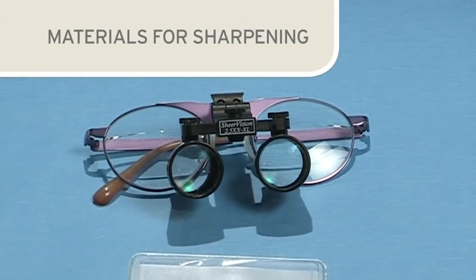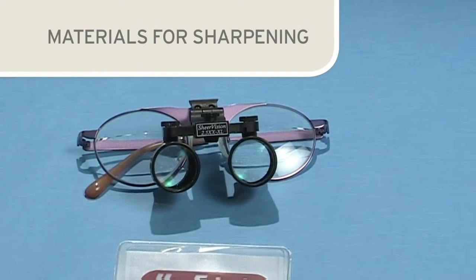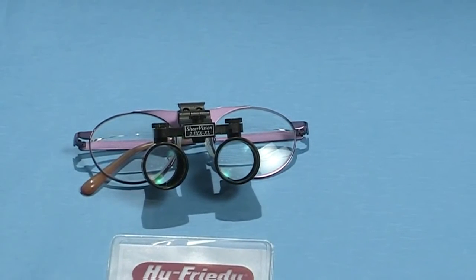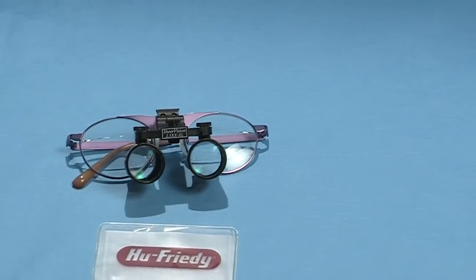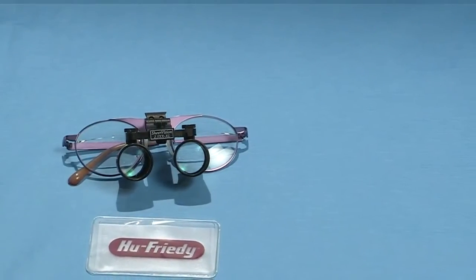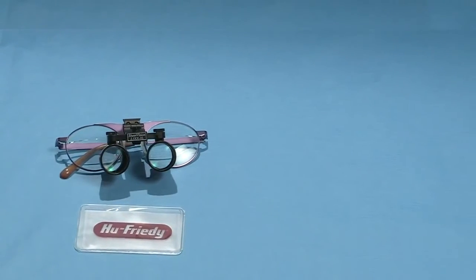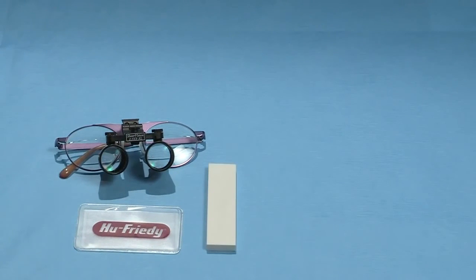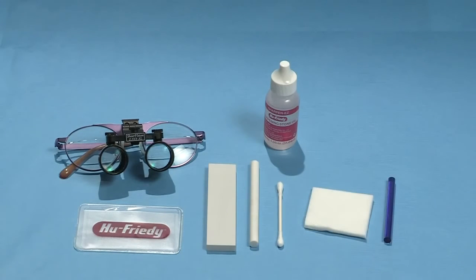Before beginning the sharpening process for sickle scalers, assemble the required materials. A sturdy flat work surface with proper lighting is essential. The use of loupes or magnifying lens is essential to clearly see the edges of the instrument blade. Also needed will be a flat sharpening stone, a cylindrical stone, oil or water for lubrication, depending on the type of stone, cotton-tipped applicator, gauze, and an acrylic or plastic test stick.